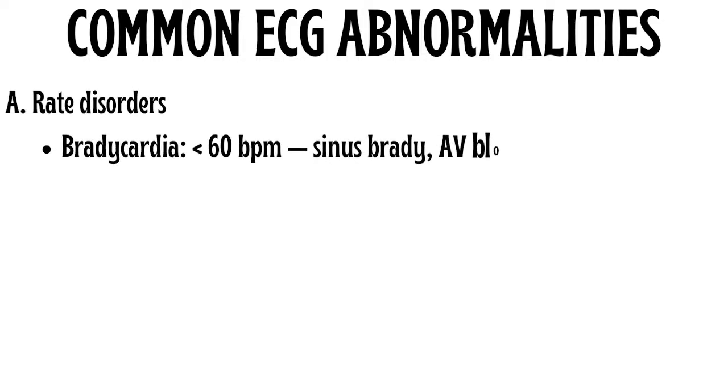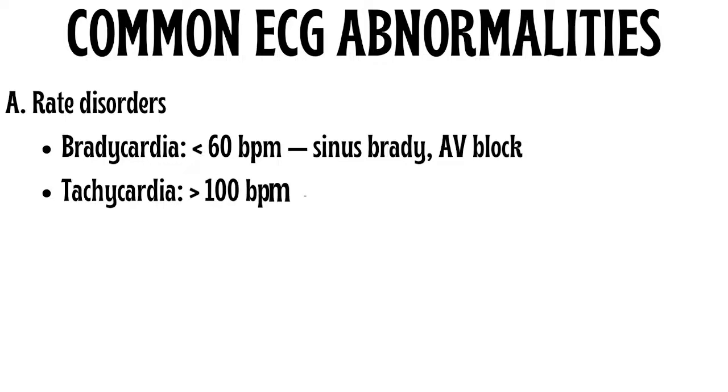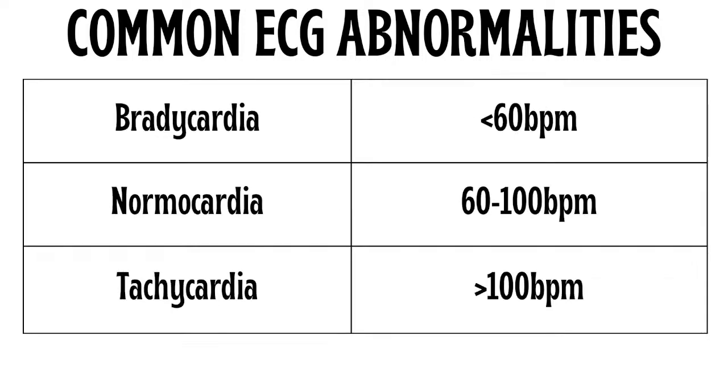Bradycardia is defined as a heart rate below 60 beats per minute. Tachycardia is defined as a heart rate above 100 beats per minute. Both can be physiological or pathological depending on the context.